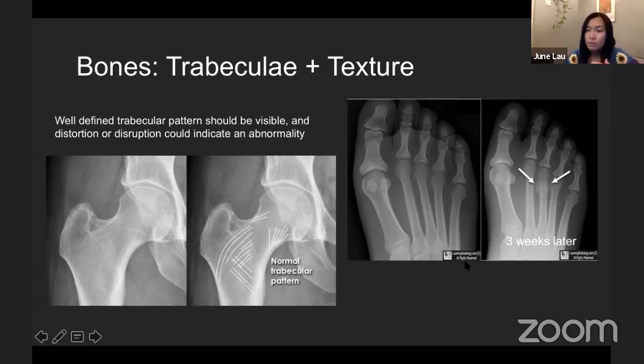The reason why the bone gets fuzzy and forms a callus is due to the periosteum. The periosteum is a little cling film that goes all over every bone, and it responds to any injury, any infection or inflammation. So sometimes you request x-rays to look for osteomyelitis or for inflammatory arthritis, and this is what you're looking for: the texture of the cortex.